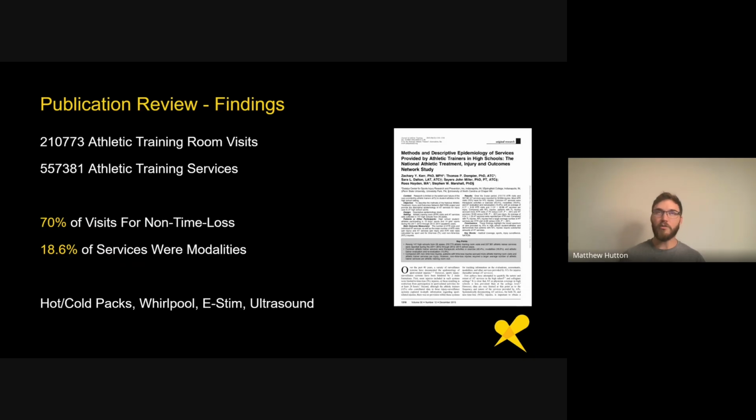If you move the water, either by the metal fan or turbine, so they're actually kicking the water and spinning it, that's the most common. These big loud things go and kick water around the tub. That is the most common way that I've seen it. But for a cheaper alternative, all you have to do is every 30 seconds or a minute have somebody take their hand and just stir the water. If you move the water, it breaks up that thermic barrier. Now you're getting cold water back on the skin. You get a stronger response to the cold water. So that's typically what whirlpool is.